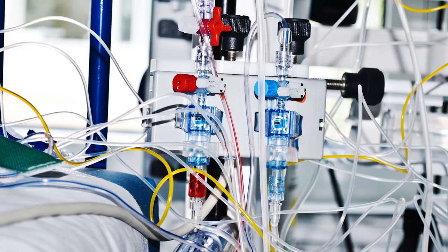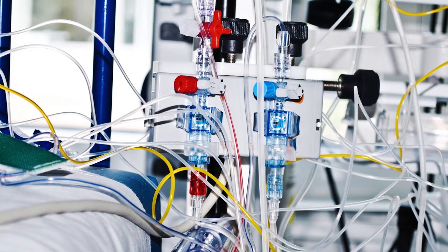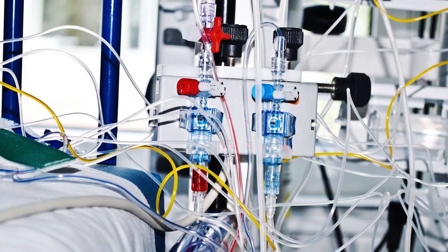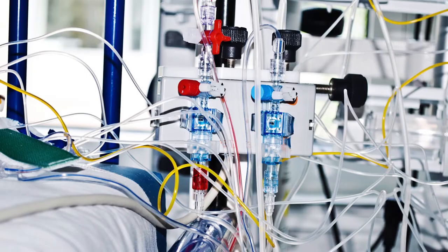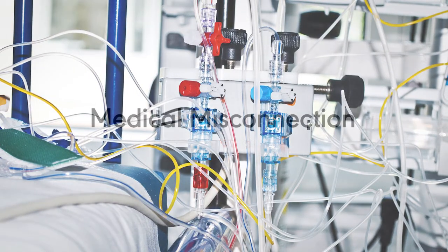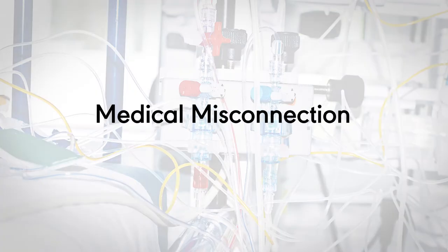Looking at this picture, even the most trained of eyes have trouble identifying all the tubing connections. Because the connectors on many devices are interchangeable, users can accidentally connect unrelated systems to one another. This is called a medical misconnection.